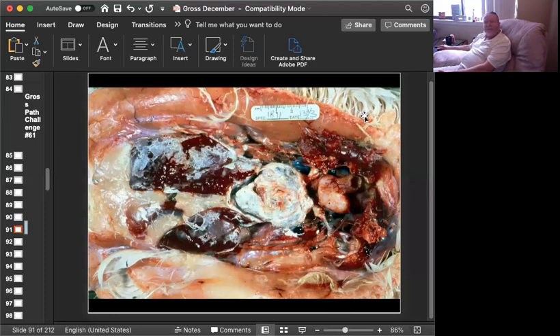Slide number 7 is tissue from a chicken. How about a morphologic diagnosis? Name the condition. Okay, time's up. Well, this is a pretty severe case of gout. This is visceral gout. I want you to use that as the name of the condition. Make sure that you differentiate visceral gout from articular gout. They're two very different conditions with different pathogeneses. And so this is visceral gout.